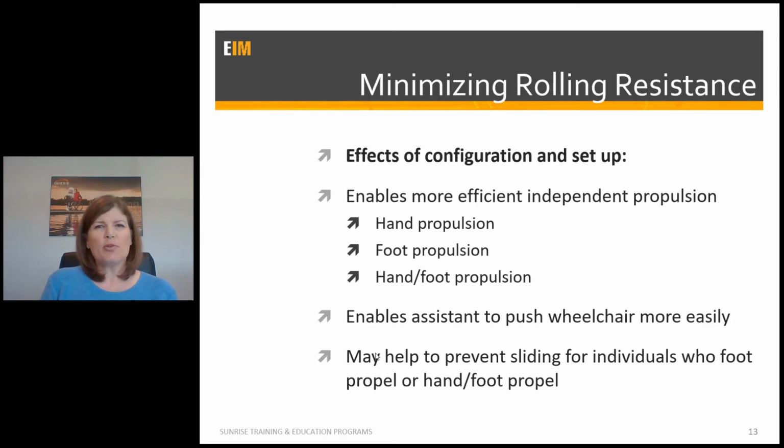And by using this sort of motion and trying to overcome the force of the wheelchair, that might cause the pelvis to slide forward, and that can contribute to sliding. Of course, there are other reasons why individuals slide from their wheelchairs, but that would be the topic of another webinar.